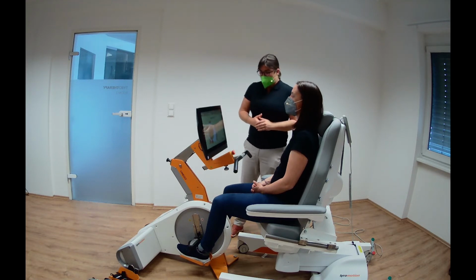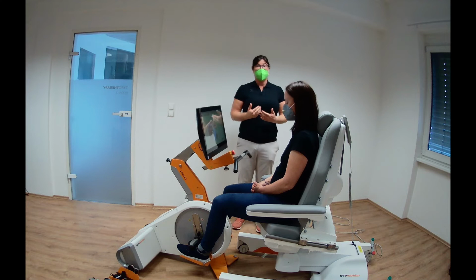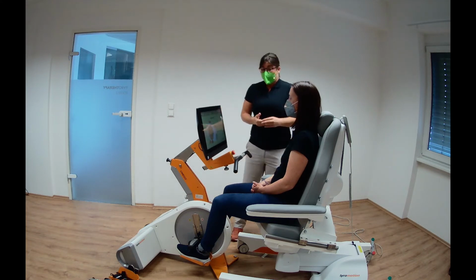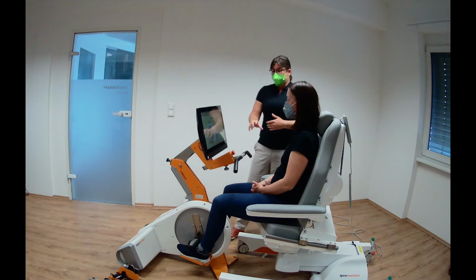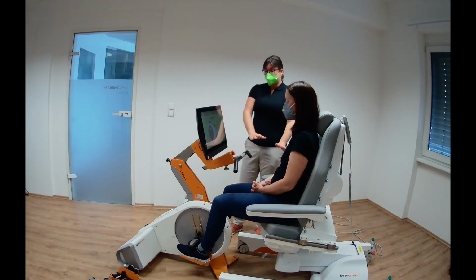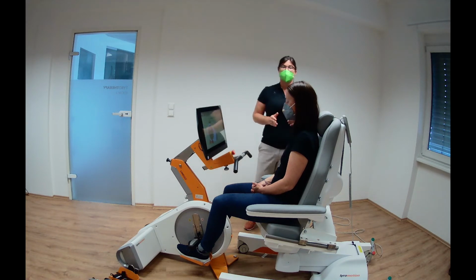So we need some kind of range of motion. If Barbara can tolerate a verticalization and a full extension in the knee, we can bring her in a very high position, which we want to show you now. On the other hand, if Barbara maybe can't tolerate it yet, or if there is a limitation in the knee extension, for example, or also in the ankle or in the hip, you can let her do the movement in this position. So you have several options to adjust all those parameters to the patient's needs.